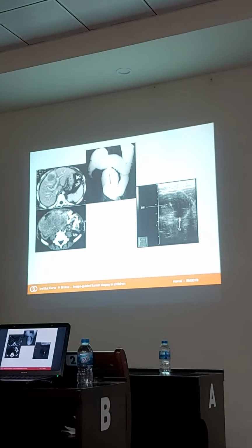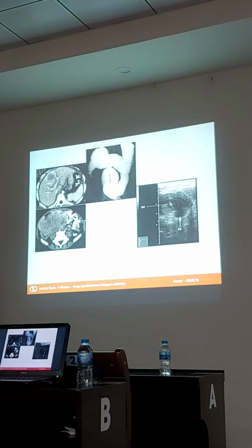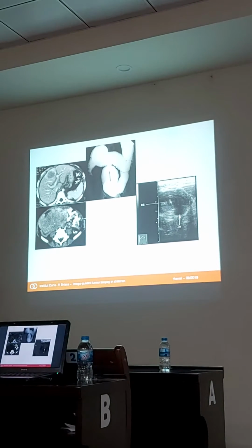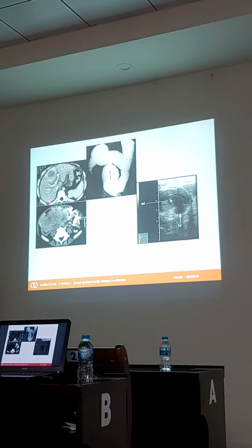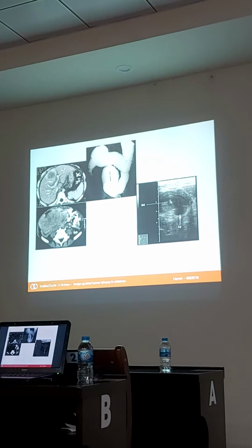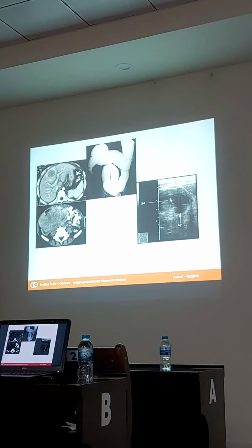is that the response of this tumor is very rapid. You have a very quick response if you treat with chemotherapy and steroids. So the bowel obstruction will go away very rapidly, so you don't need surgery. So we will just do a fine needle aspiration. We can go through the anterior wall, it's not a problem, because there is already peritoneal dissemination, so never mind.